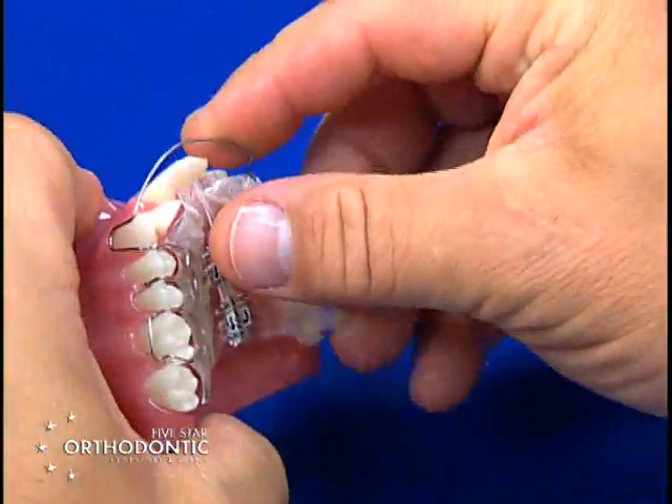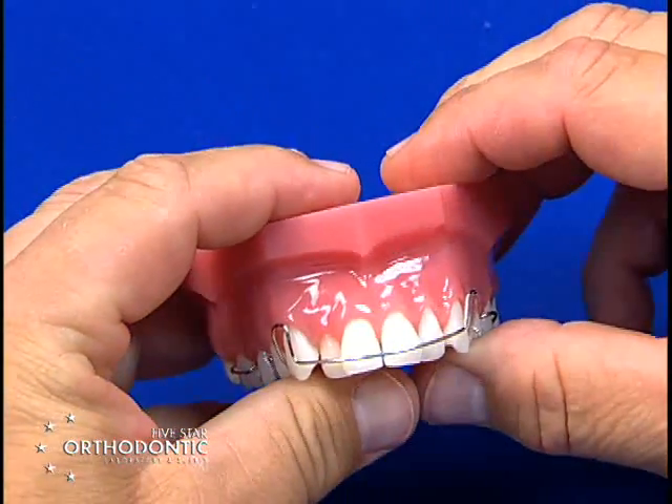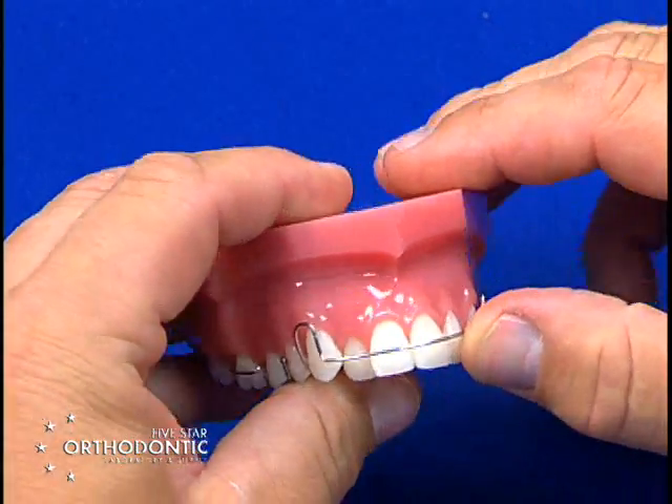Place in contact — you then have the bow level with the incisors and ready to go.